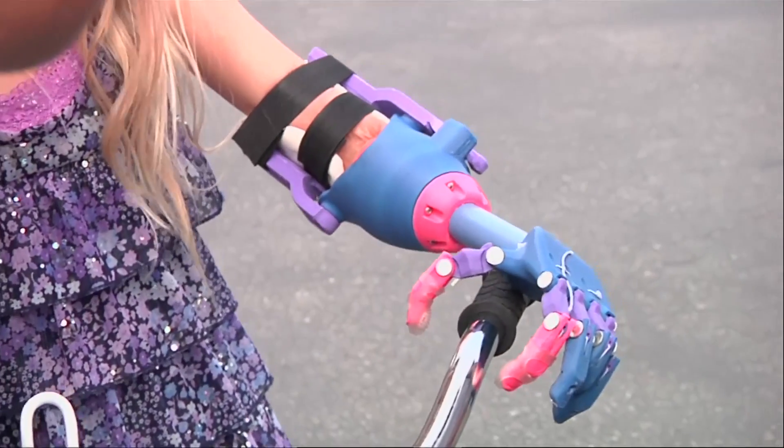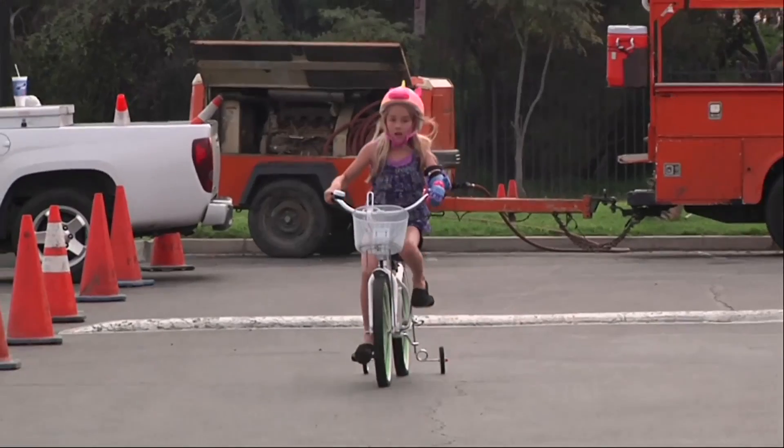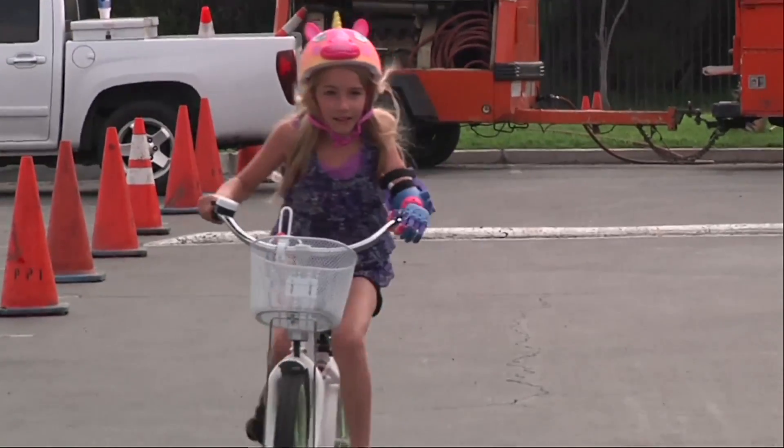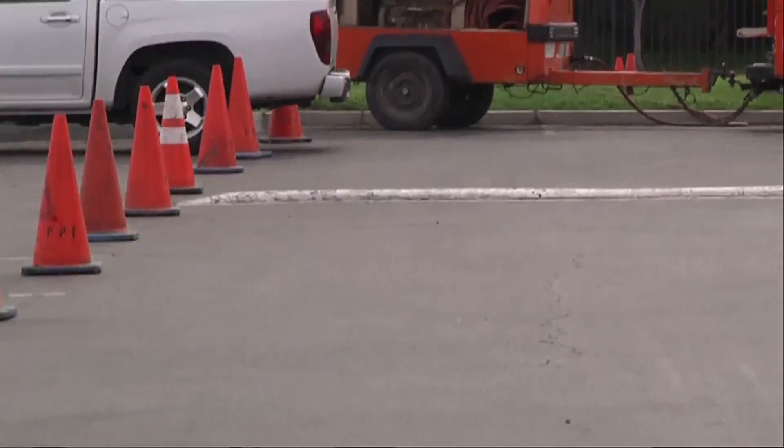She was just out front riding her bike a little while ago. It's made it easier for her to balance and to distribute her weight more evenly without having to lean so far. It feels light.